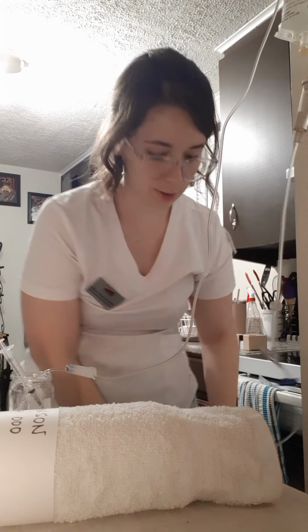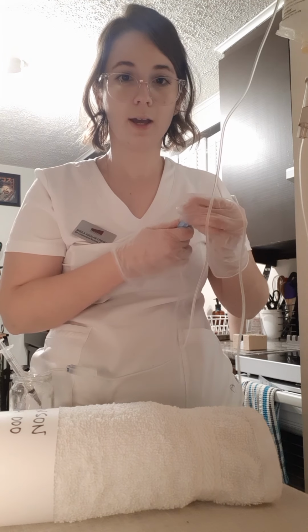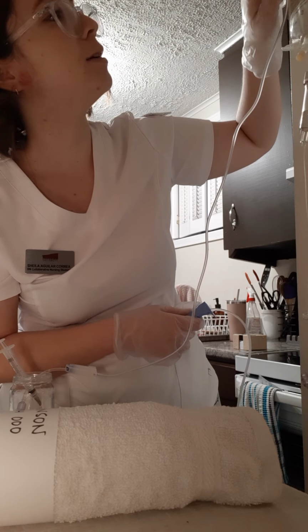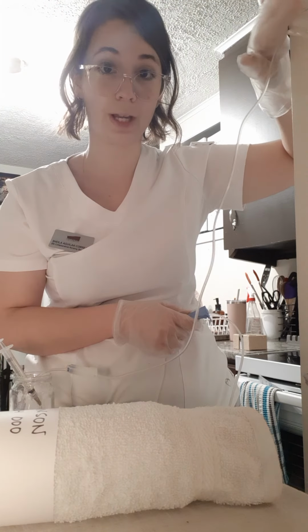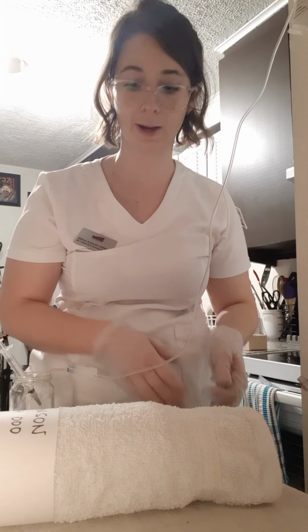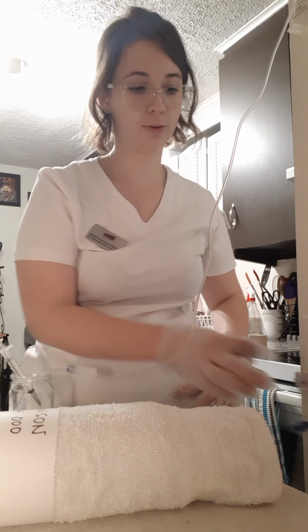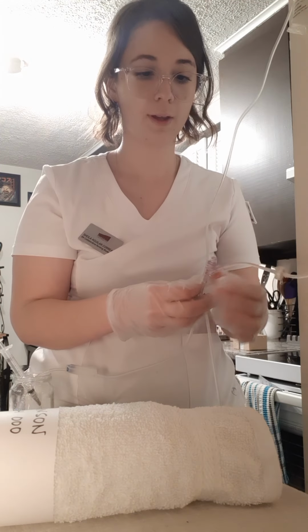Okay, so I'm going to close this line here, and I'm going to note how much went in. So 150 milliliters of the primary line went in, and I'm going to record that into my in and out sheet. So I'm going to clean the port closest to the IV bag.